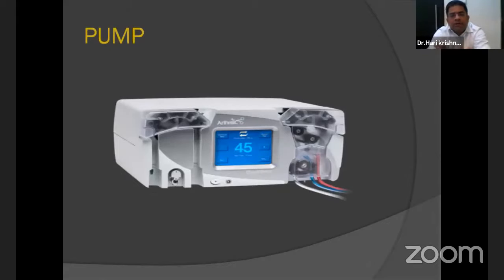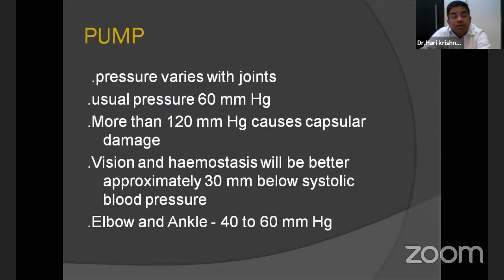Regular use of pumps is most commonly seen in the shoulder joints, but not much in the knee joints. So if I am using a pump, how much pressure should I keep in the pump? It varies with the joints, and the usual pressure is 60 millimeters of mercury. More than 120 millimeters of mercury causes capsular damage and articular damage, so it should not increase beyond 120 millimeters of mercury.